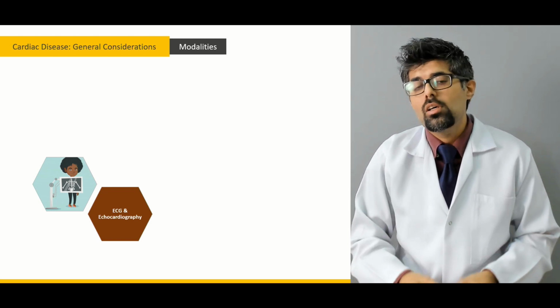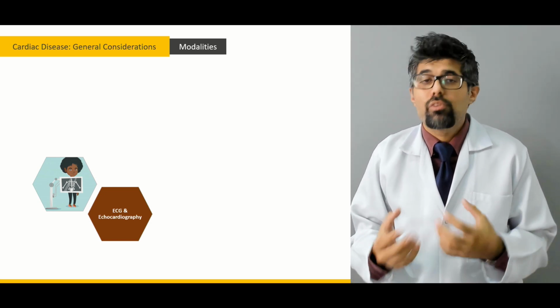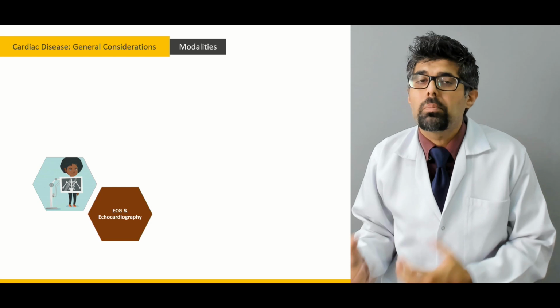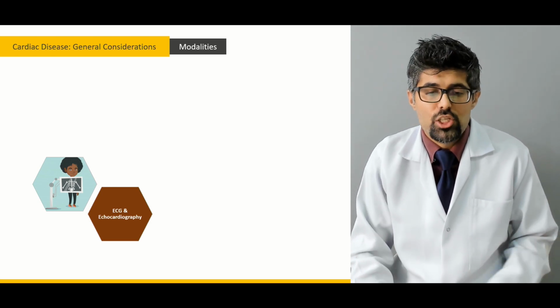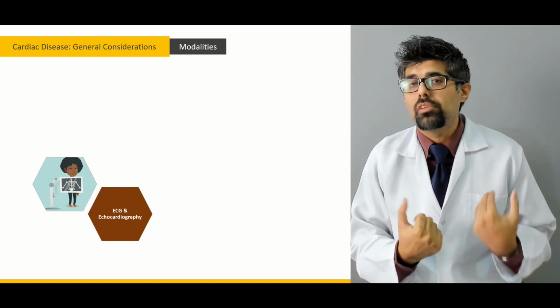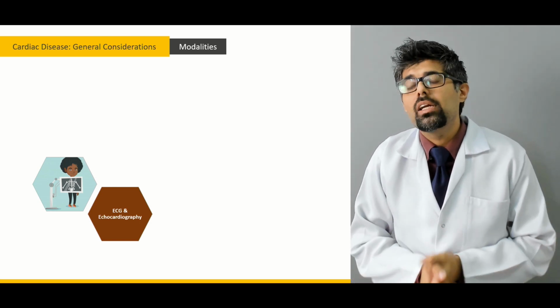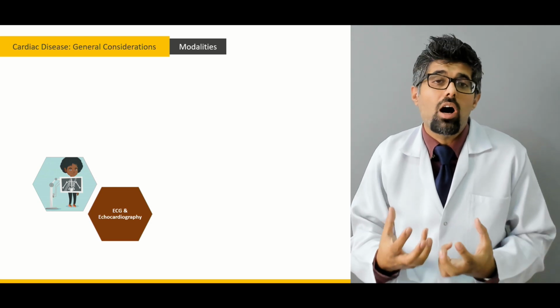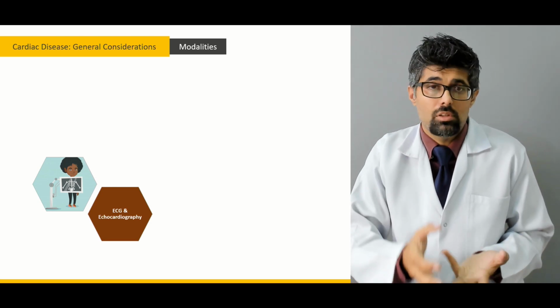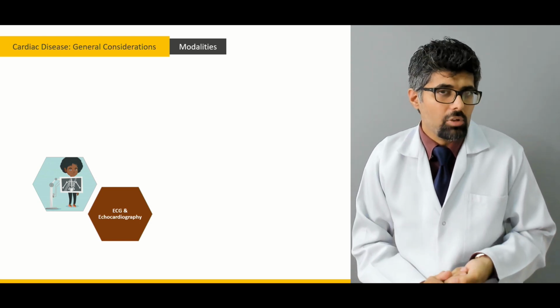Any patient with a cardiac disease, acute or chronic, first gets the normal cardiac workup, which is composed of the ECG and the echocardiogram. The ECG is the electrical activity of the heart, which is sensed through the skin. Echocardiography is basically the ultrasound of the heart in motion. We can study both the ventricles, the valves, the major vessels, the aorta, and the superior and inferior vena cava.